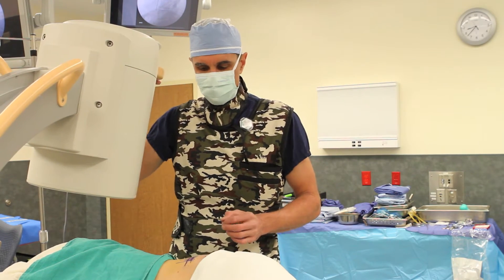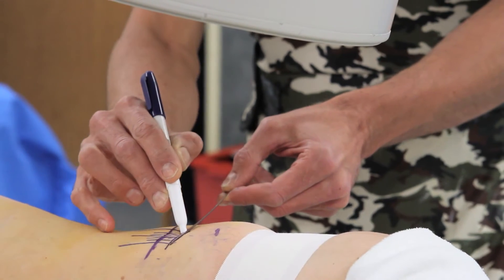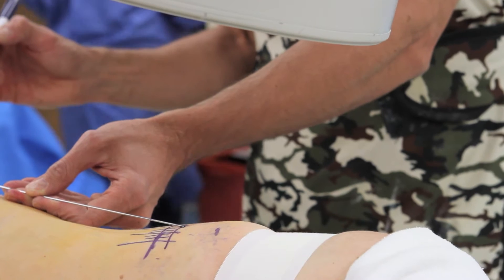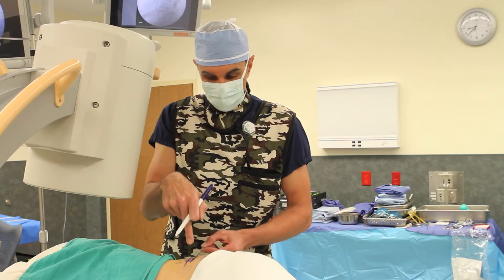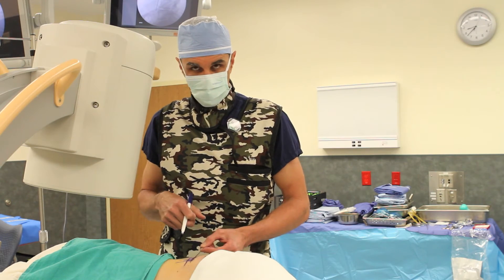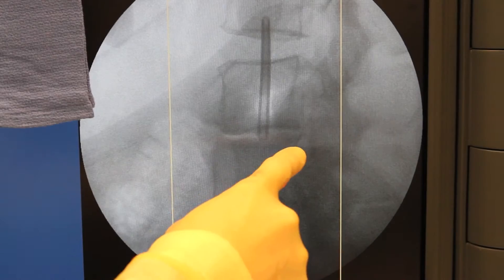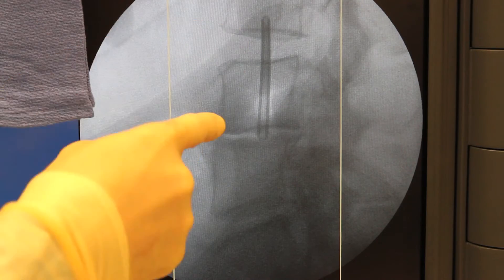Using the fluoroscopy unit, we identify an entry point to make an approximately one-inch to one-and-a-half-inch incision to go down to the disc space and perform the fusion. Intraoperative imaging and neuromonitoring is used to identify a safe trajectory to the affected disc. Here's the L4-5 disc space with my first dilator positioned at the center.